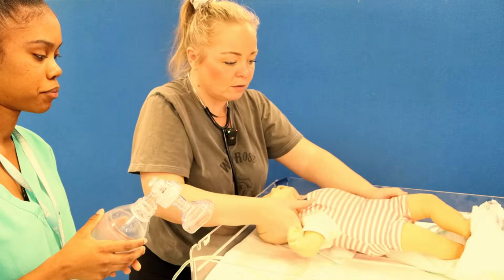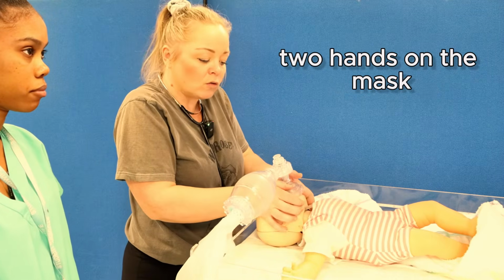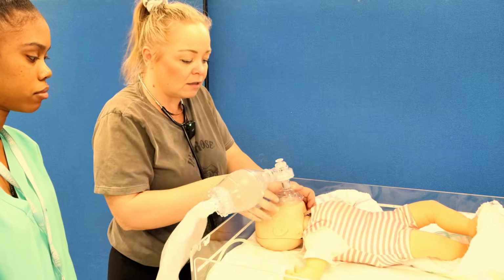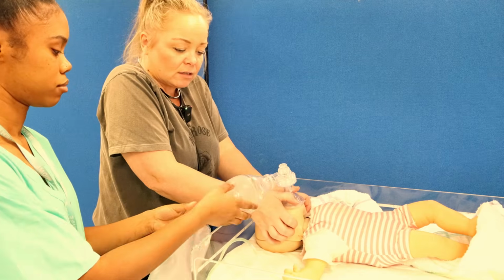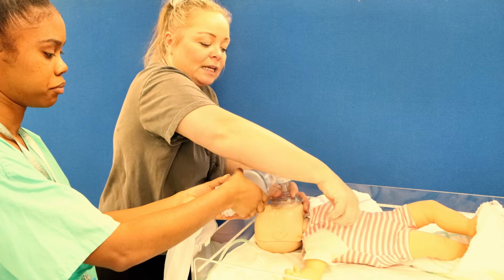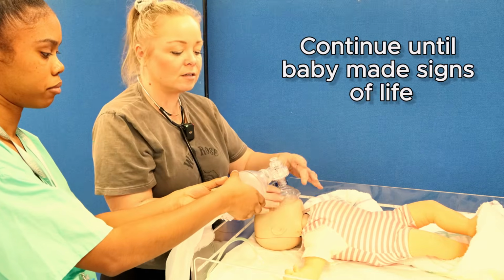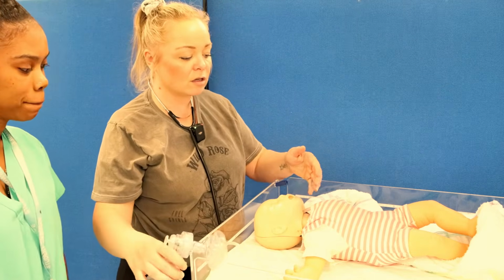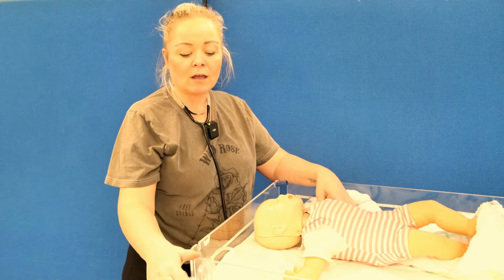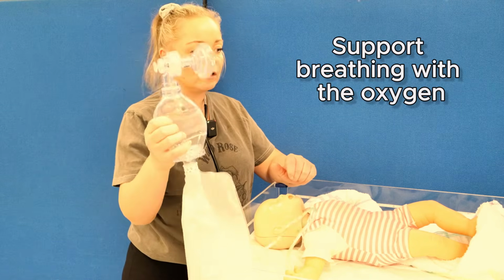The other difference also with baby is once help arrives, the gold standard for neonates, paediatric, adults is always to have 2 hands on the mask, just in case you get a slight air leak with the 1-person technique. So if I hold the mask with 2 hands, my glamorous assistant here, if you just squeeze the bag once for me, lovely. And then someone at the bottom could use a 2-person technique with their thumbs to deliver the compressions. And you would continue until baby made signs of life. As I mentioned, if the baby doesn't automatically have a strong heart rate, please continue. And if their breathing isn't back to normal, we can just support their breathing with the oxygen.